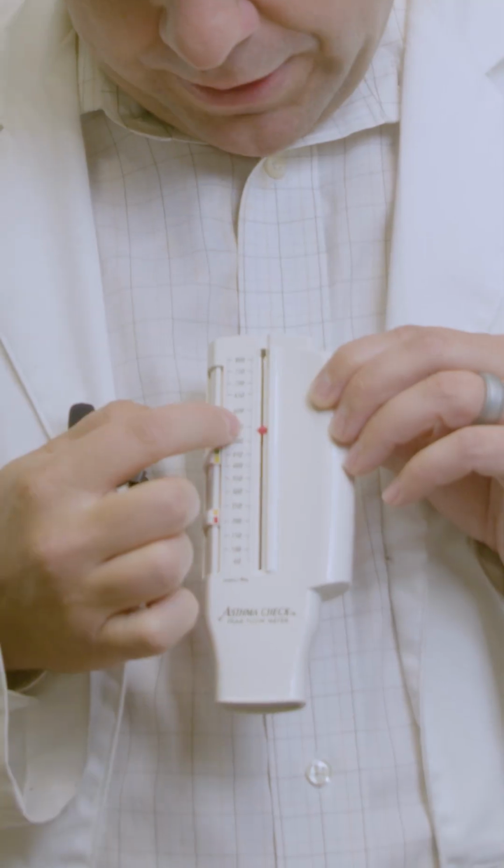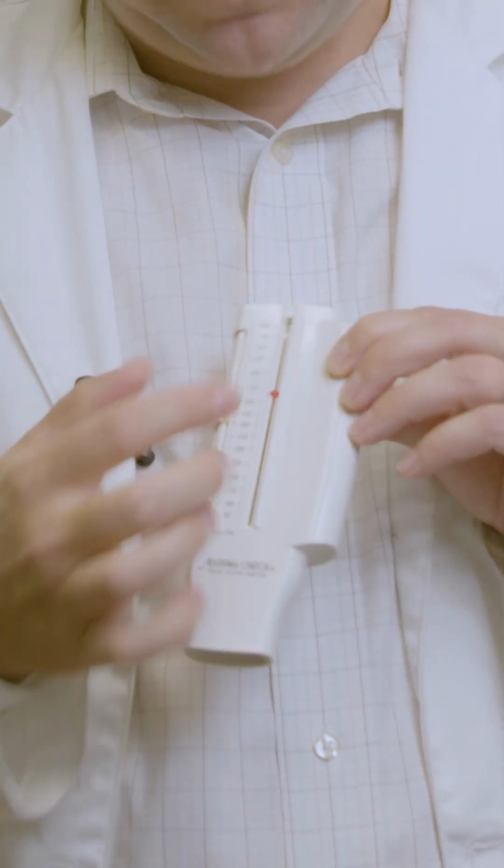And you can see that that red dot has now moved up to where it needs to be. My peak flow meter today was 550 liters a minute. Probably need to use my inhaler.